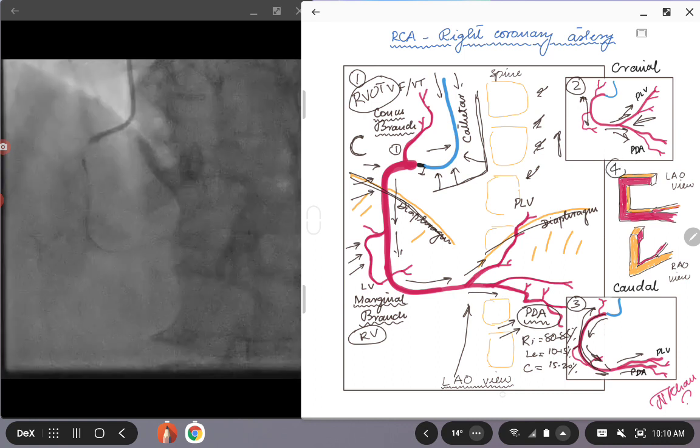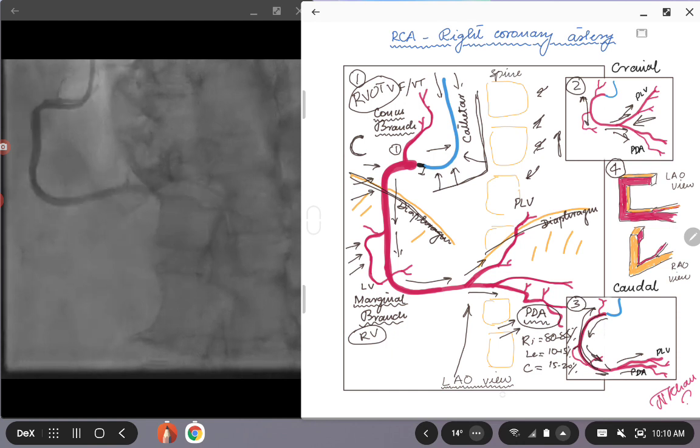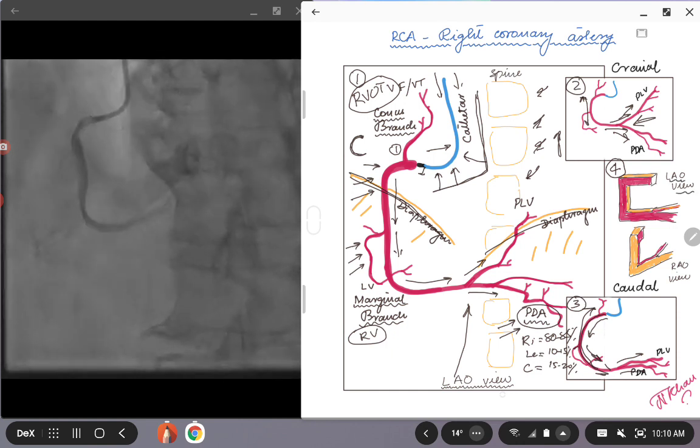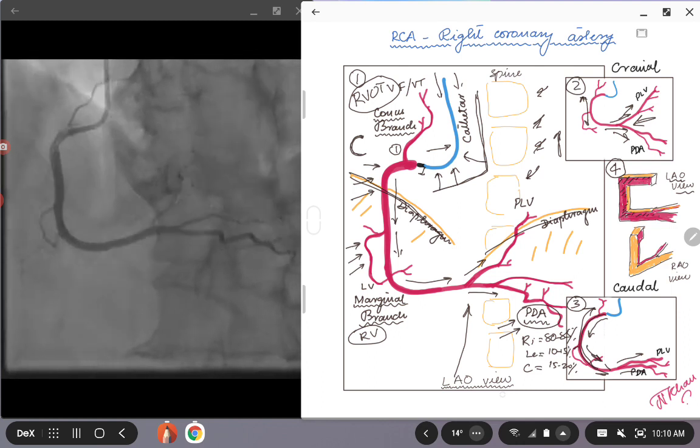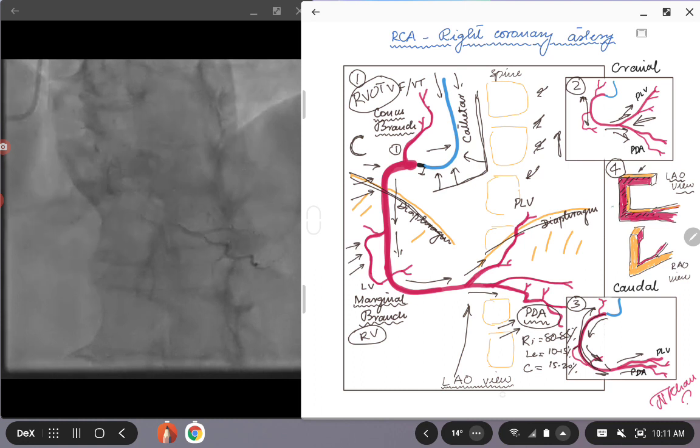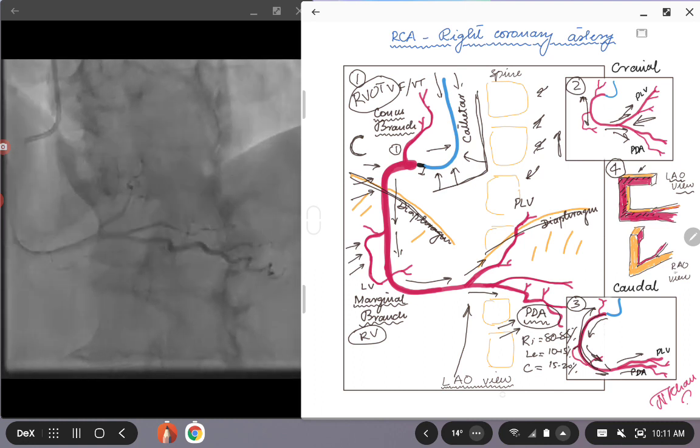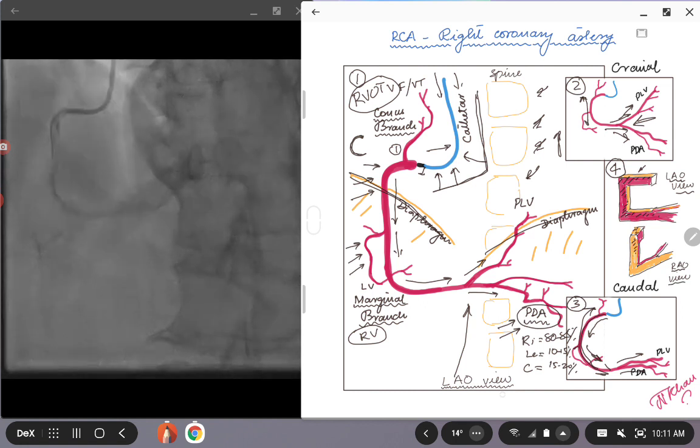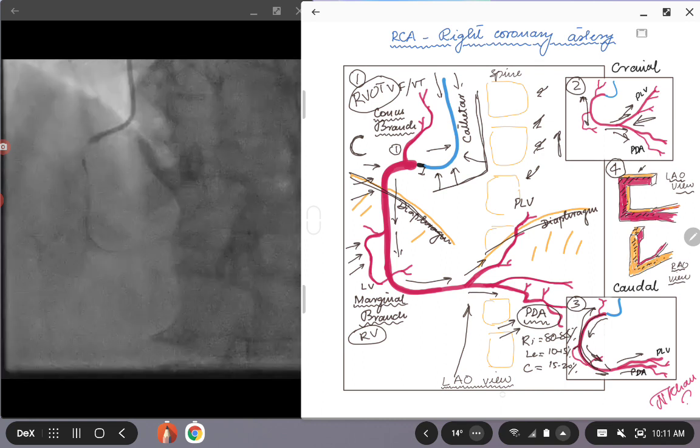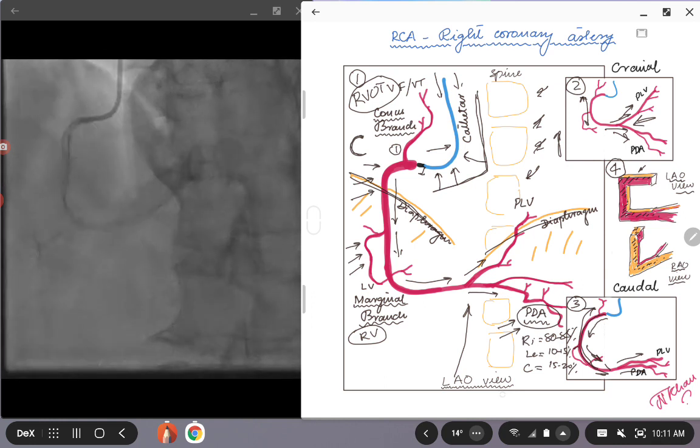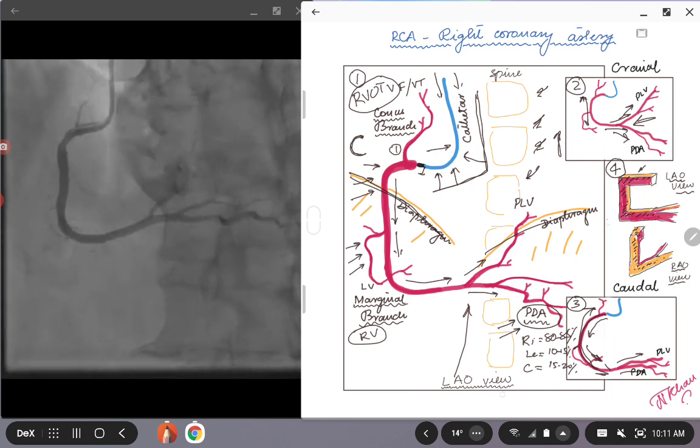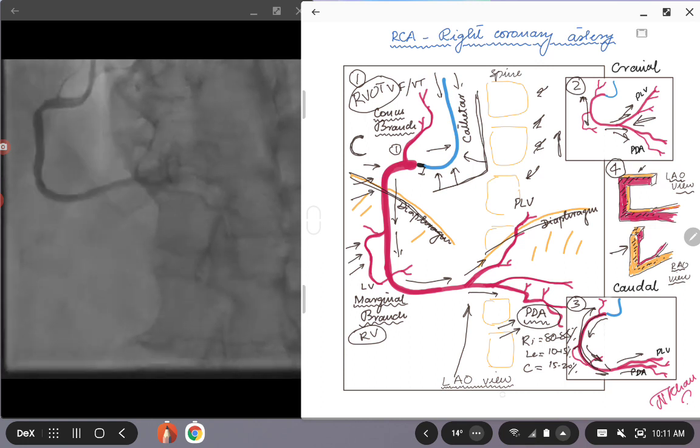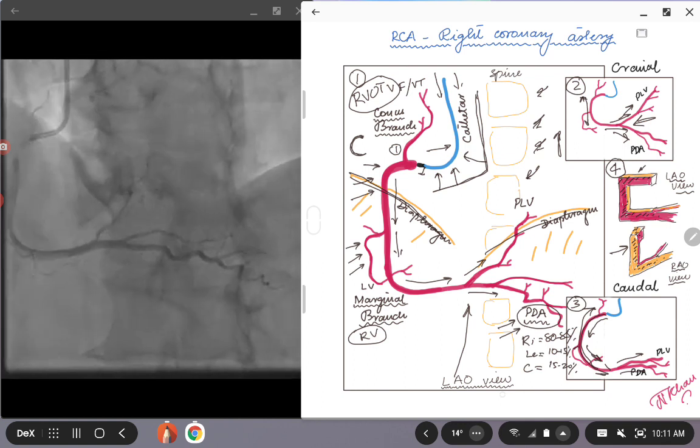With that, we move on to picture four here. It's kind of a little diagram to look at the right coronary artery. So if you are in an LAO view, basically this is the wall or the two-dimensional area of the right coronary artery that you will be able to see. The one in yellow is the area of the right coronary artery that might not be obvious in the LAO view, and that's when you have to move the II to the RAO position. That's where you can see the portion of the right coronary artery that was hiding away from you, colored yellow in this diagram, will be more obvious. And the one that you are seeing in the LAO view will be switched toward the other side so that you might not be able to see. So that way you can see the right coronary artery in two different orthogonal views, making sure you don't miss an eccentric stenosis.